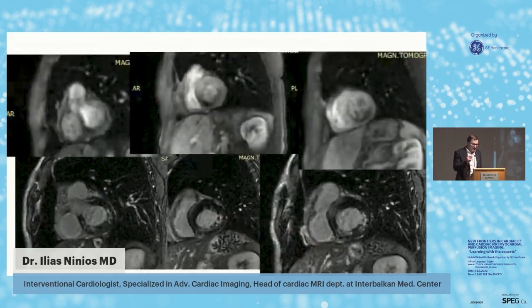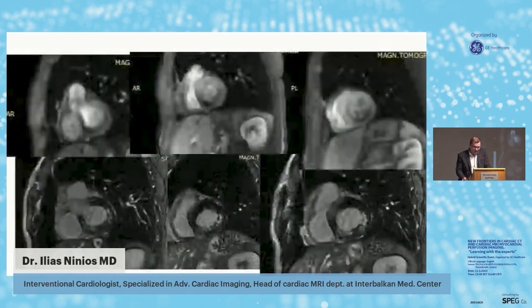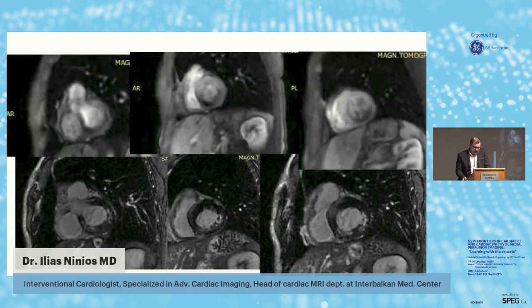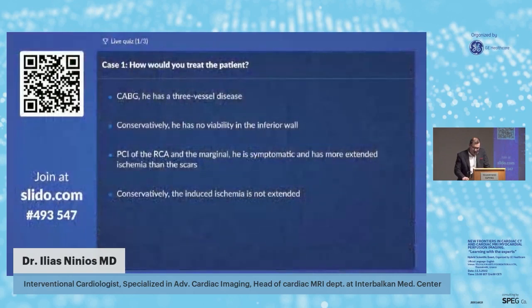And here we have the static images compared to the late enhancement images of the left ventricle. And back. So, the questions, please. How should we go further with him?